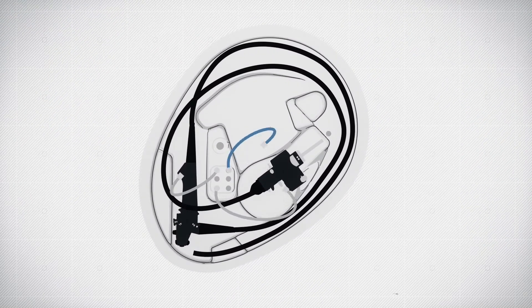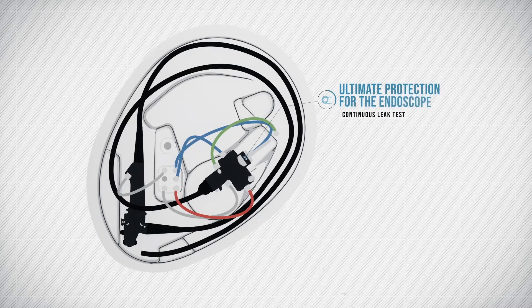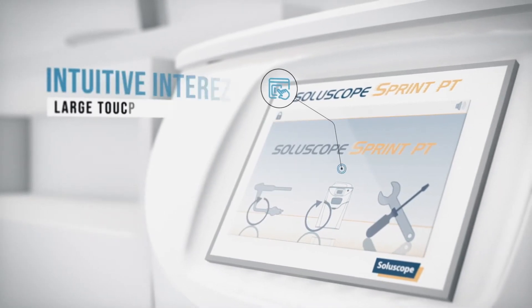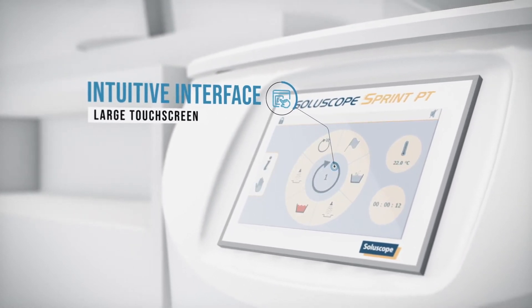The specially designed connectors ensure not only that the connection is reliable, but they also protect the endoscope all through the reprocessing phase, thanks to the leak test. It takes just three clicks on the large, user-friendly tactile screen to launch the cycle.